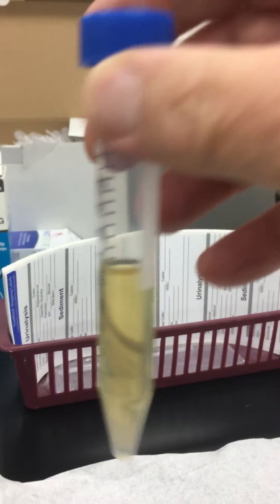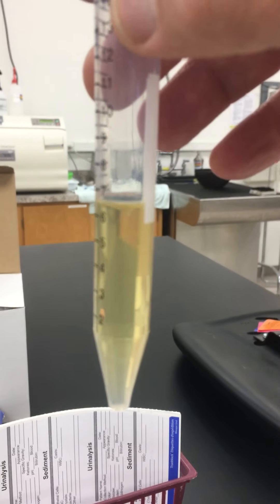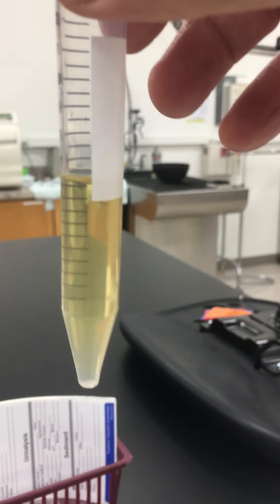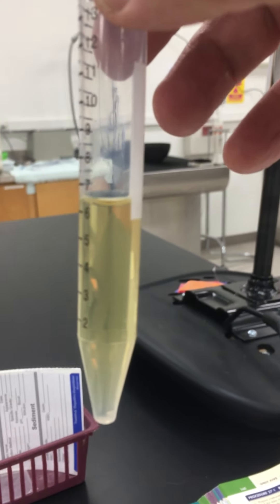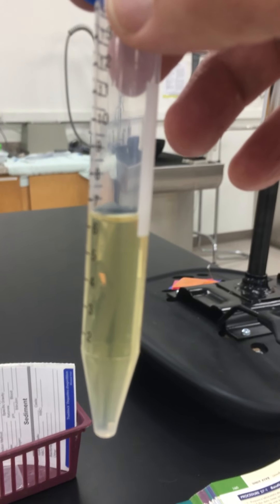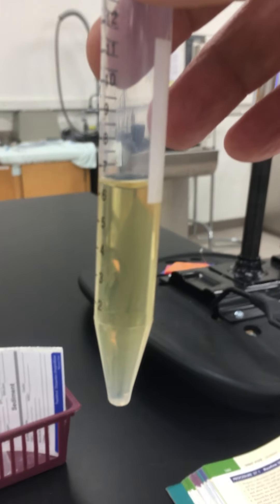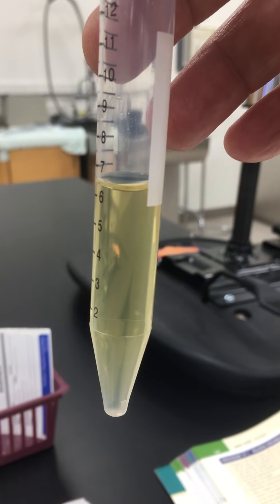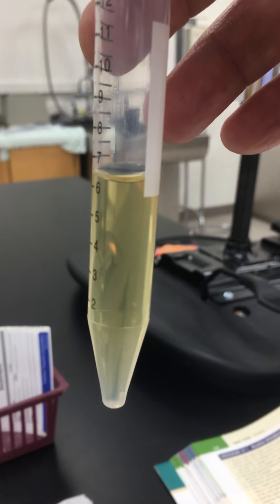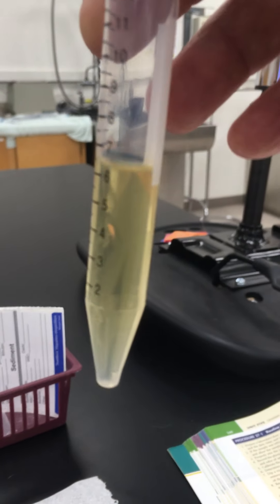What we'll do first is take a look at the urine and look at the color. Her urine is just kind of a light yellow. You'll see urine of all sorts of different colors — it can be even lighter yellow than that, almost like water, which is very dilute. Or it can be very dark yellow; sometimes you'll see red or brown.